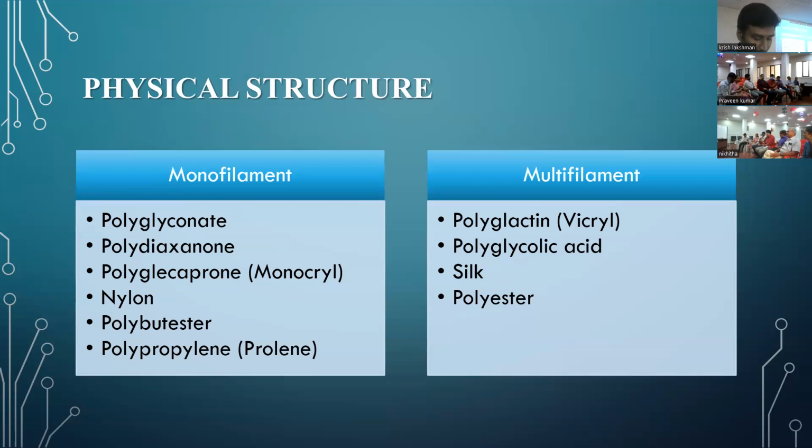One more advantage, same way, advantage of monofilament versus multifilament. That we already mentioned, correct? What happens if the bacteria get lodged in multifilament? Because a suture doesn't have its own blood supply, you can't expect antibiotics or your body's immunity to reach in between and kill the bacteria.